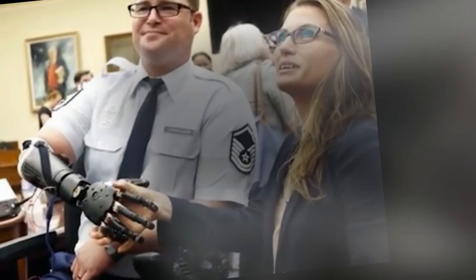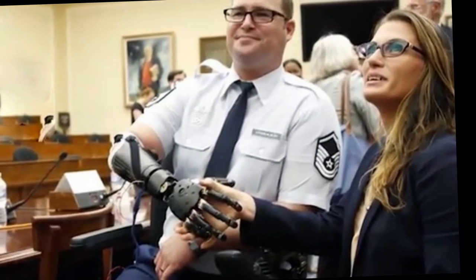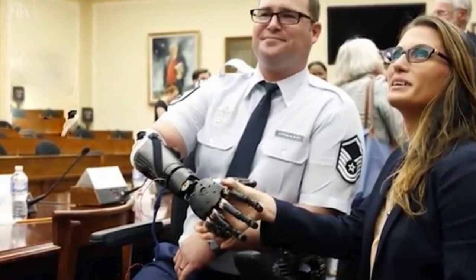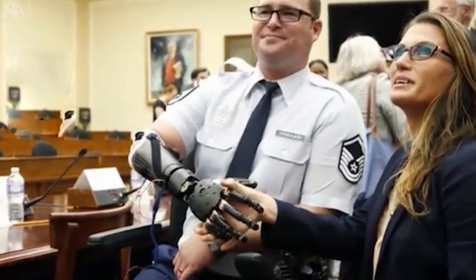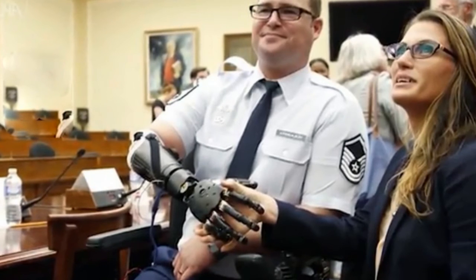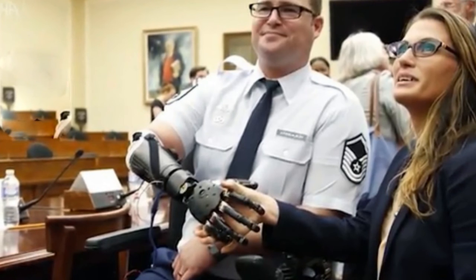"Before, the only way I could put the prosthetic on was by this harness with suction and straps, but now, with osseointegration, the implant does away with all that," said Matheny after the MPL was attached. At first, researchers planned to move forward cautiously after the MPL was attached to Matheny's body by Richard McGuff, chief of musculoskeletal oncology at the University of Pittsburgh Medical Center. But Matheny had done research and was prepared, allowing the exercises to launch right away.